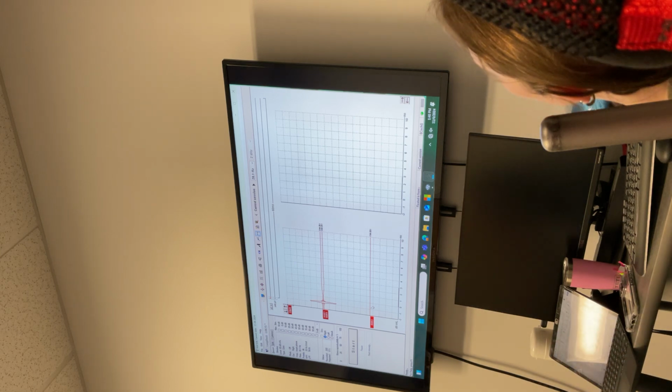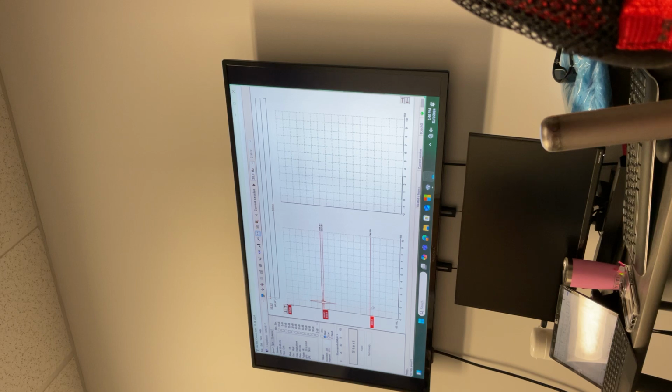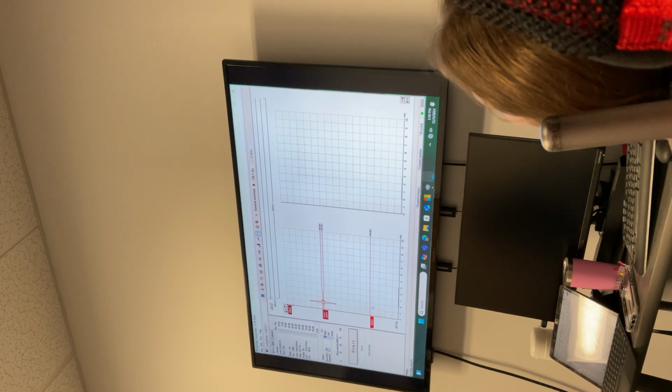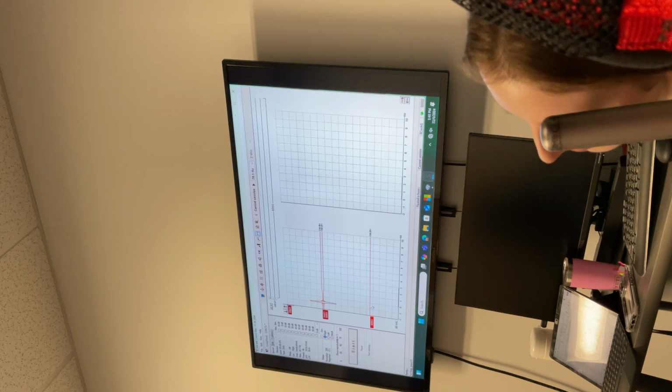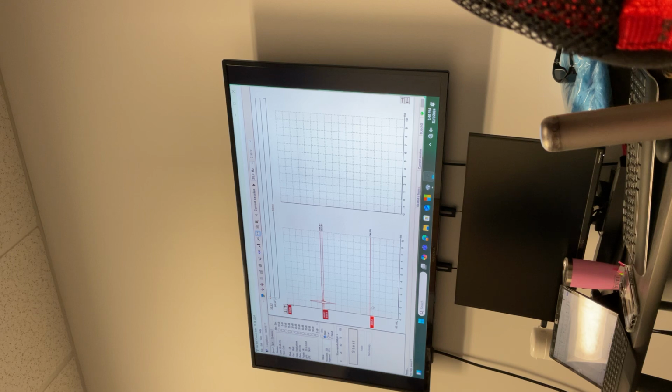Is it just at this intensity that it gets canceled out, or you just can't use alternating with a click? You can use click alternating. The energy is getting cancelled because first one is rarefaction, second is condensation, rarefaction, condensation. But the neural response will occur for each stimulus. That's what you're averaging.